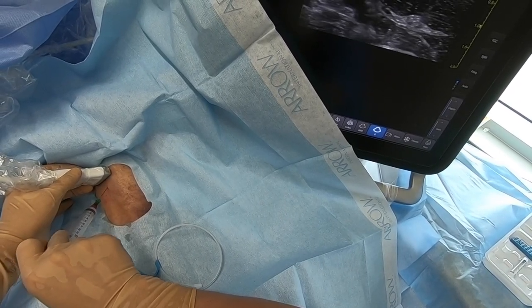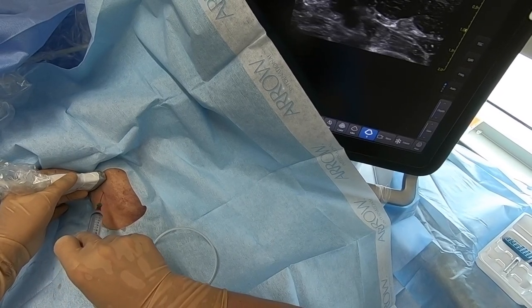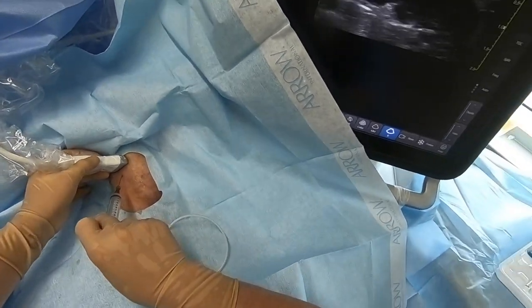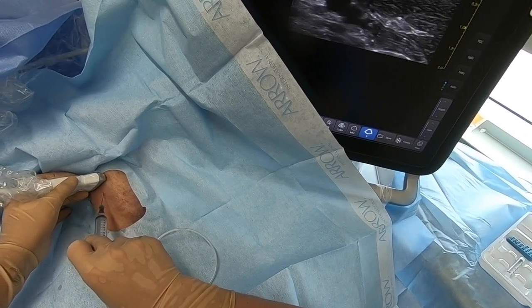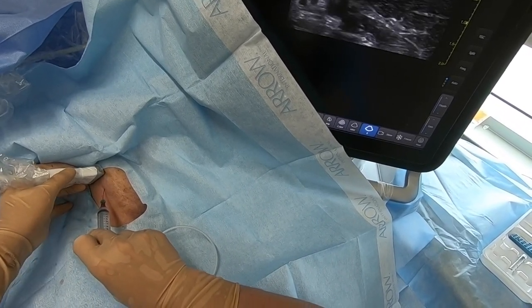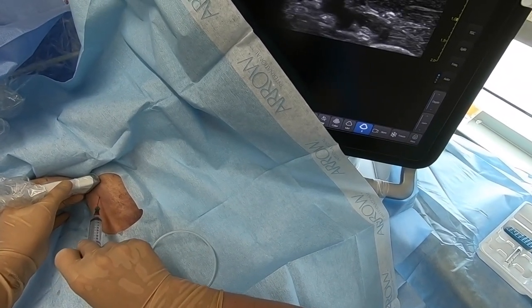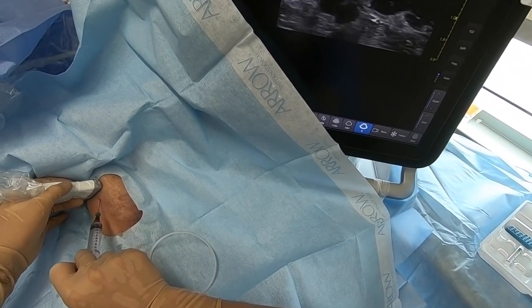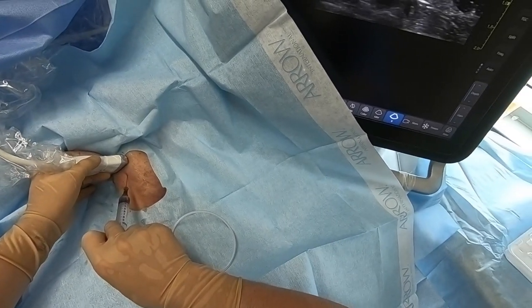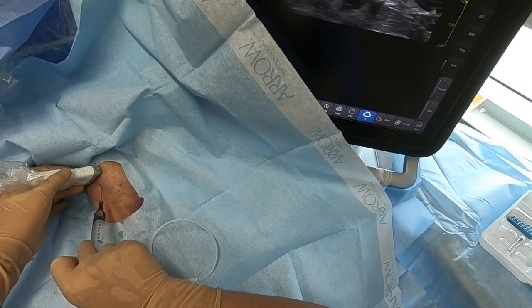As soon as we enter the tissue, we set up a continuous brisk but small-amplitude bouncing movement with the needle, which helps our visualization by displacing tissue. We're going to follow our way all the way down to the brachial vein, avoiding the nearby artery and also a nearby nerve bundle, which can be hard to see. Sometimes you'll have to rely on the patient's complaints if you do hit it. If you're good at nerve blocks, you're probably going to be better at noticing that.